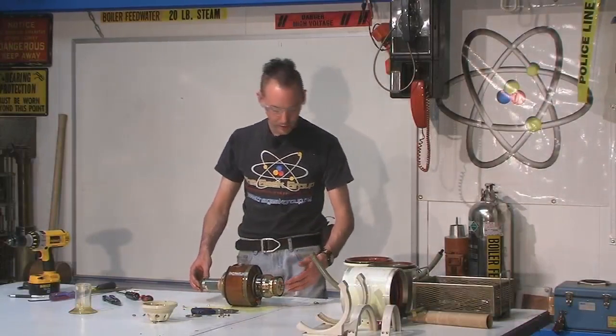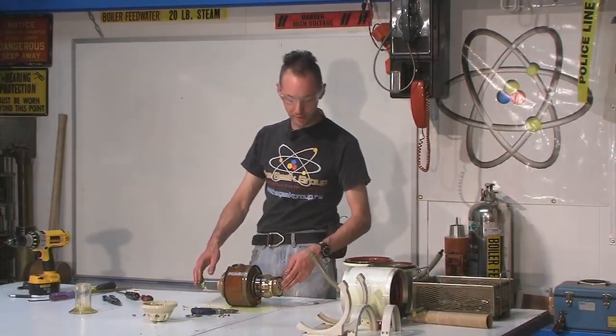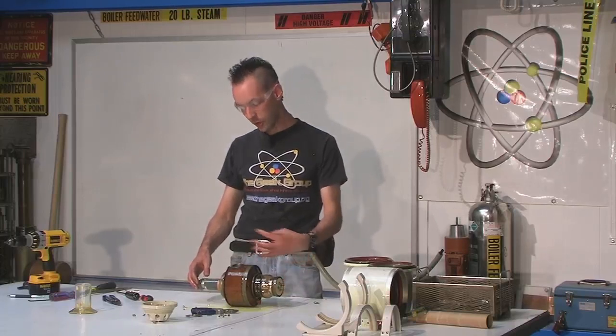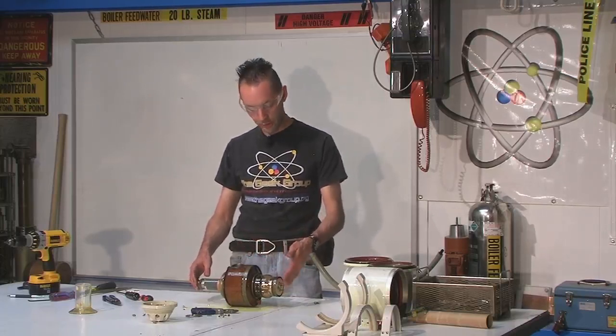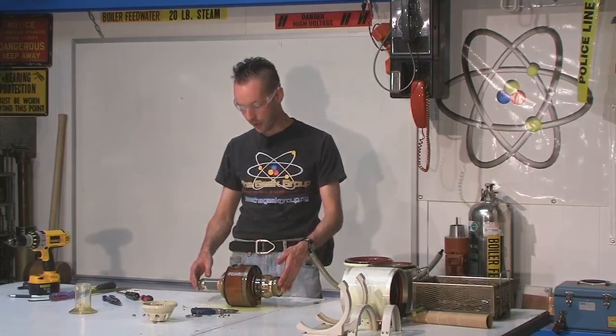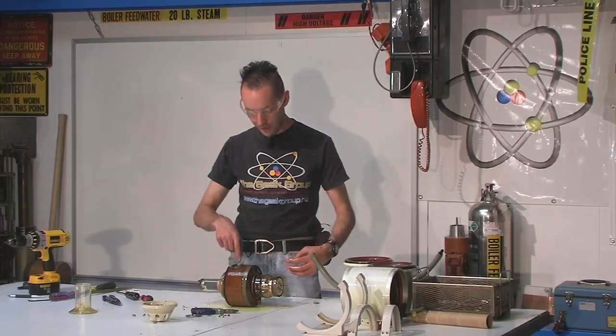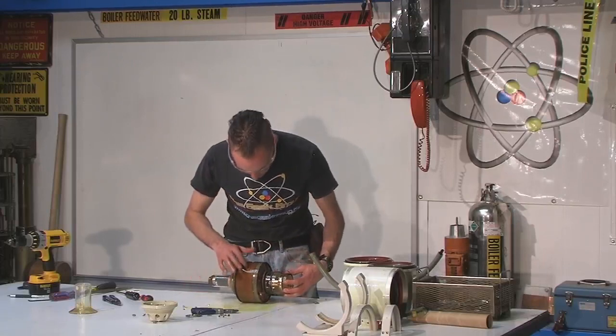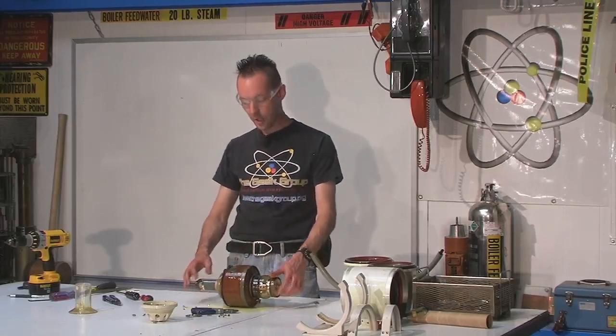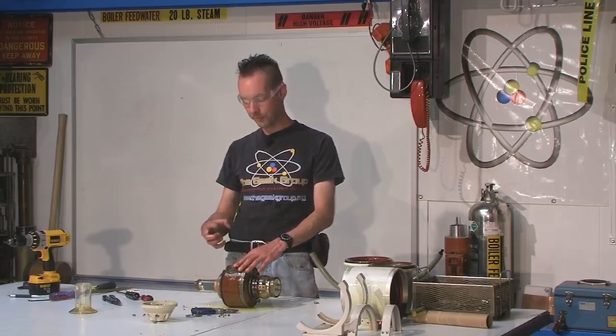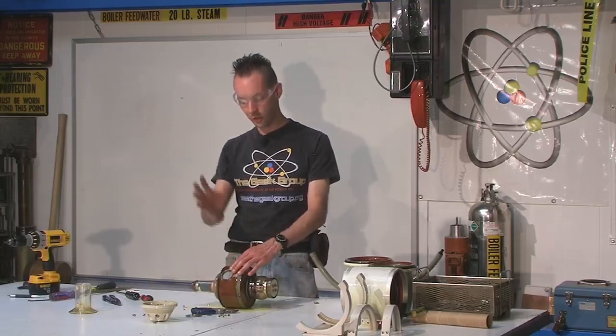And the way this works is the filament end and electron gun is at this end. So you're shooting electrons across. So this would be the cathode end and this would be the anode end. And you're shooting electrons across. And in the center here, you can't see it because it's hidden under all this copper shielding. But there's a target and it's a big chunk of tungsten. And when it hits that, it shoots off x-rays.